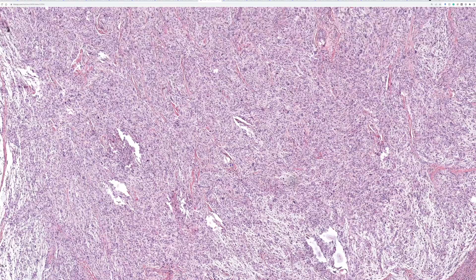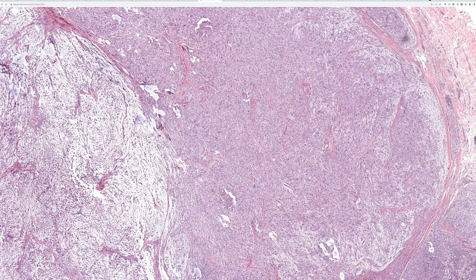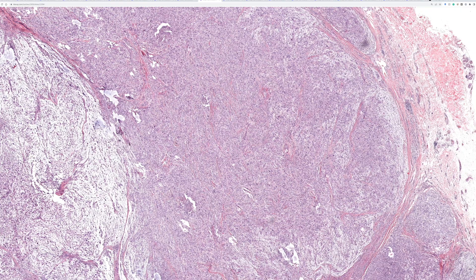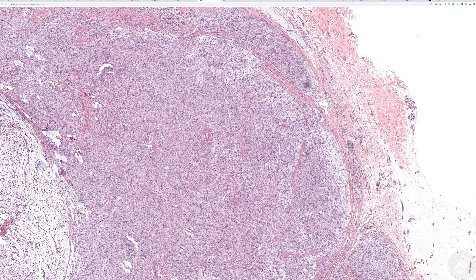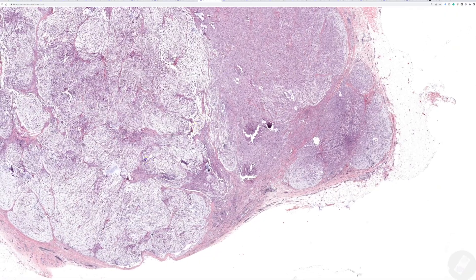Other markers like PGP9.5 and MITF are reported in this tumor, but the problem is they're all pretty non-specific and most can stain melanocytic and histiocytic things - which are your main differential. If it looks like cellular neurothecoma and I do S100 or SOX10 and it's negative, I feel pretty happy making the diagnosis just by ruling out a melanocytic tumor. Purely cellular cases without myxoid areas can have tight nesting that really resembles a Spitz nevus or other melanocytic tumor, so excluding melanocytic lesions is really important.